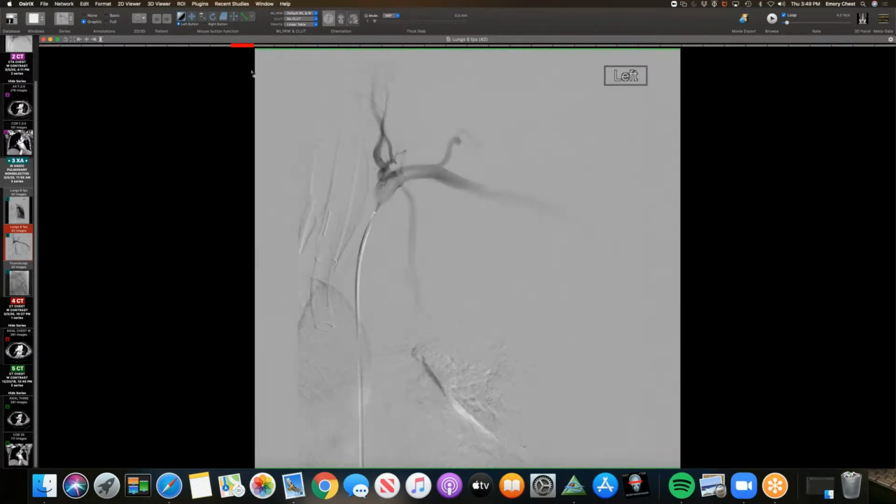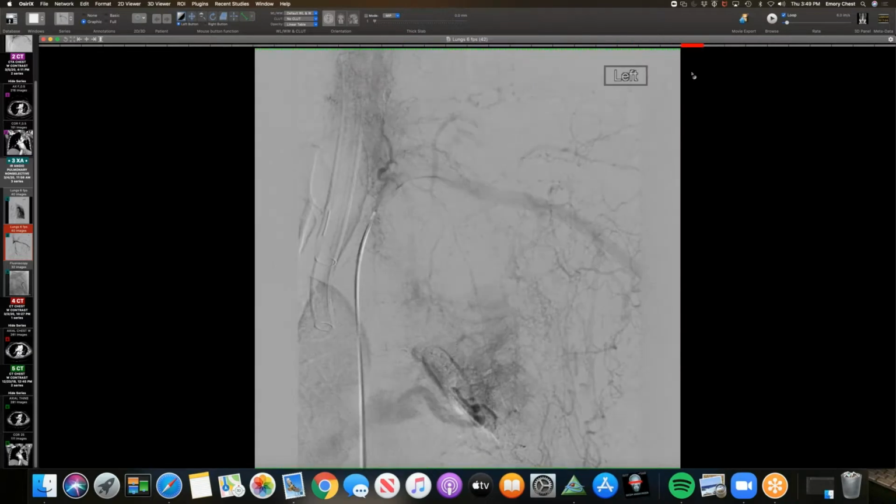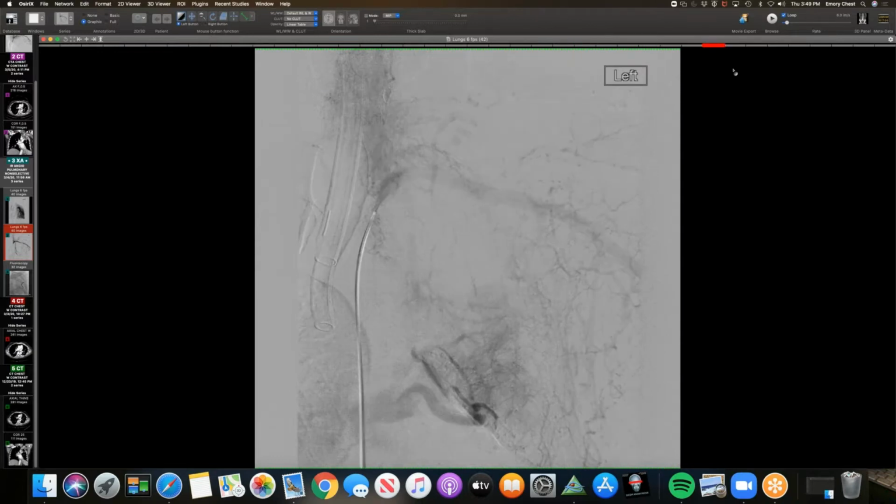And then here, on the same study, they did a follow-up run. You can see them here in the subclavian artery. You can look at this case, I think it's great. And I thought I saw it on, yeah, you can see it right there. So this patient developed, and I hadn't seen this, all this neovascularity going into the lung from the subclavian artery, including the pseudoaneurysm.